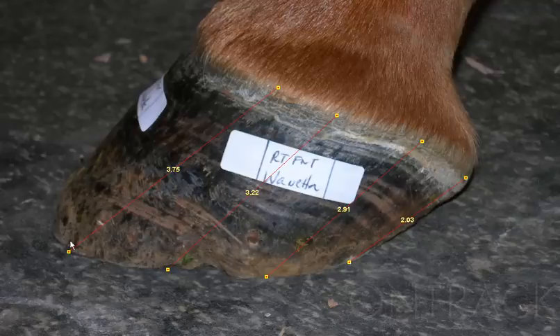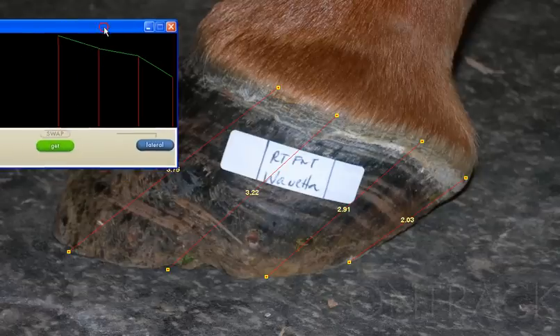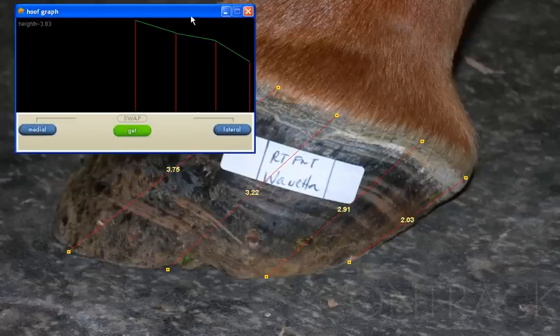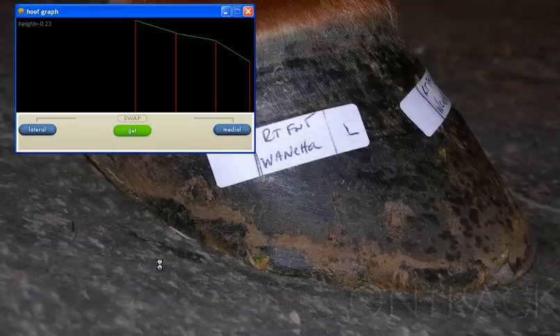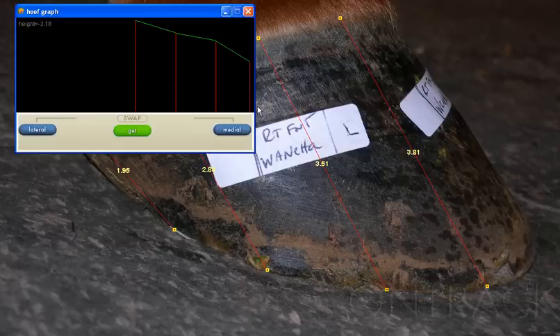This would be the medial aspect of the foot. If we go ahead and graph this foot — this is the medial — we're going to swap that out and load up the lateral image. Here's the lateral; we'll get the information on the tubular lengths here.